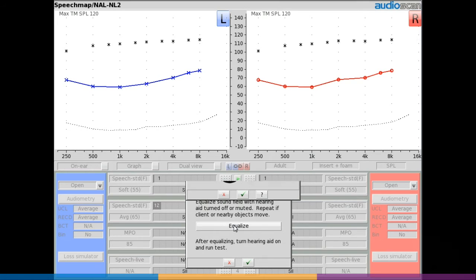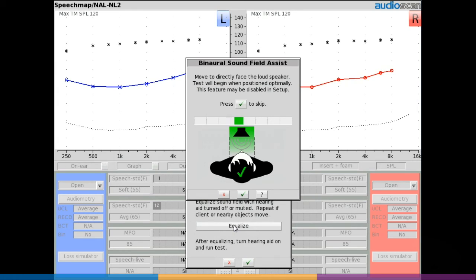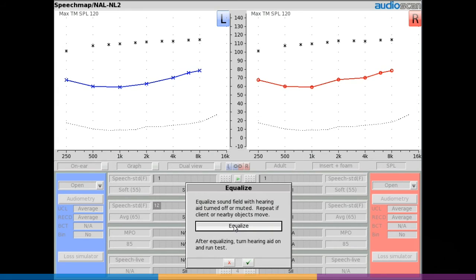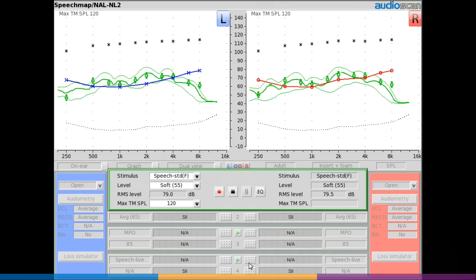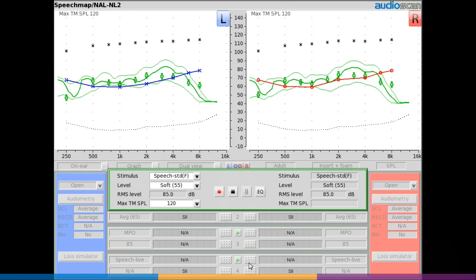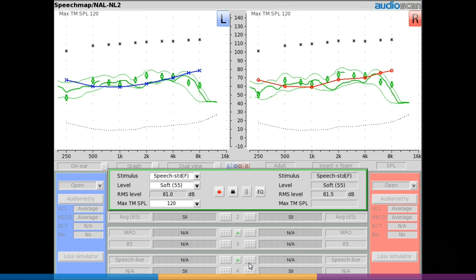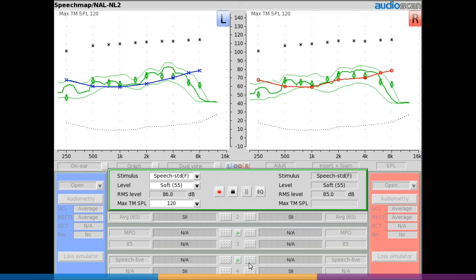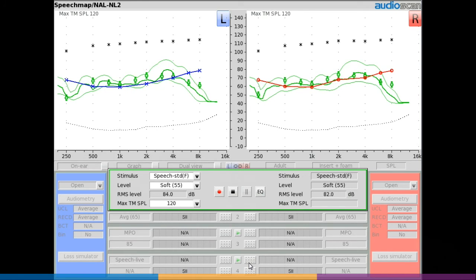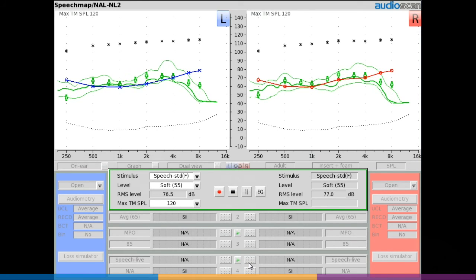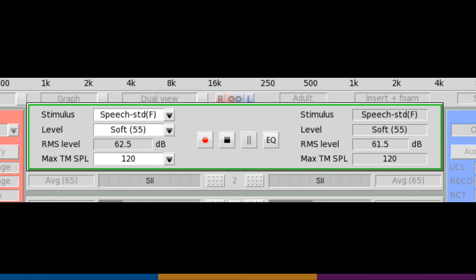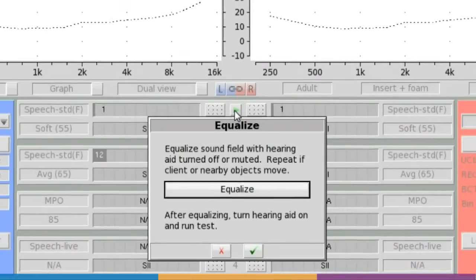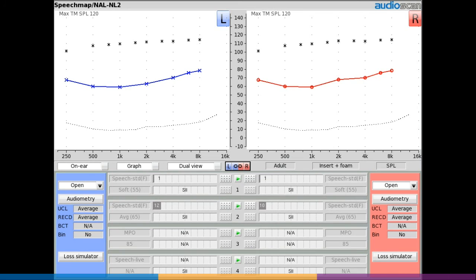If fitting binaurally, this is when the patient adjustment prompt will also appear should the sound field input level be different between the reference microphone locations. Because open fittings use this stored sound field equalization for all subsequent tests, it's important that the patient remain in the same position and that the sound field be kept static. If the clinician believes a change in patient position or test environment has occurred, simply select the EQ button on the speech map screen to rerun the sound field equalization. If a position adjustment is required, the binaural sound field assist tool will be presented to guide patient placement.